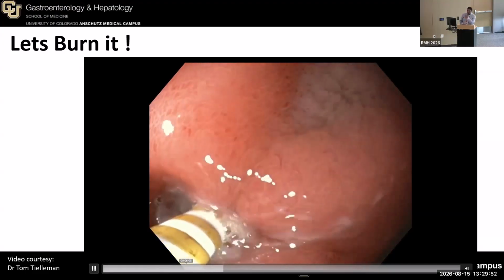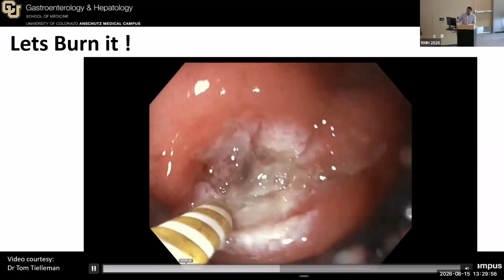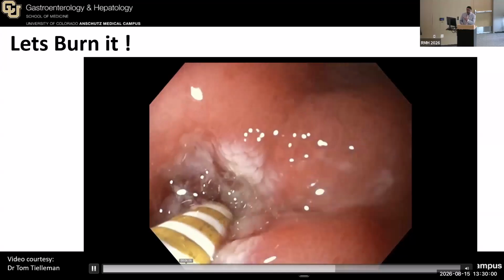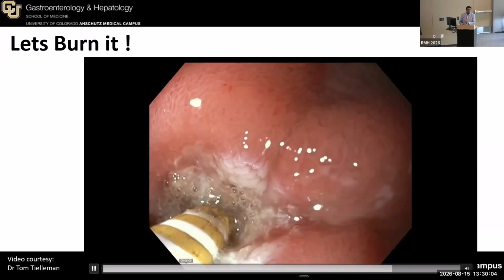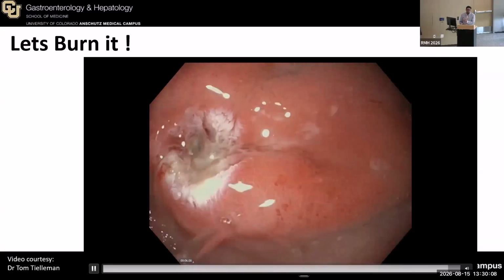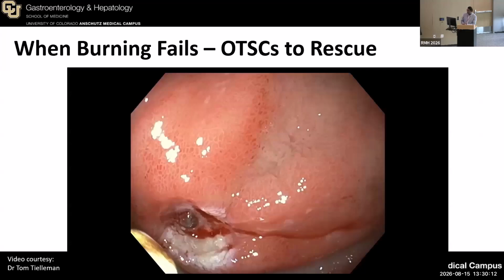So you're really putting mechanical pressure on it. So it's coaptive coagulation. Right now, all we've done is basically use it like an APC catheter, haven't really tried to coapt and put pressure with the gold probe. So you have to actually press on the vessel an uncomfortable amount, especially if it's a deep ulcer. There's always a concern that you perforate, but if you decide that that's the tool you have to use, you really have to go at it aggressively.